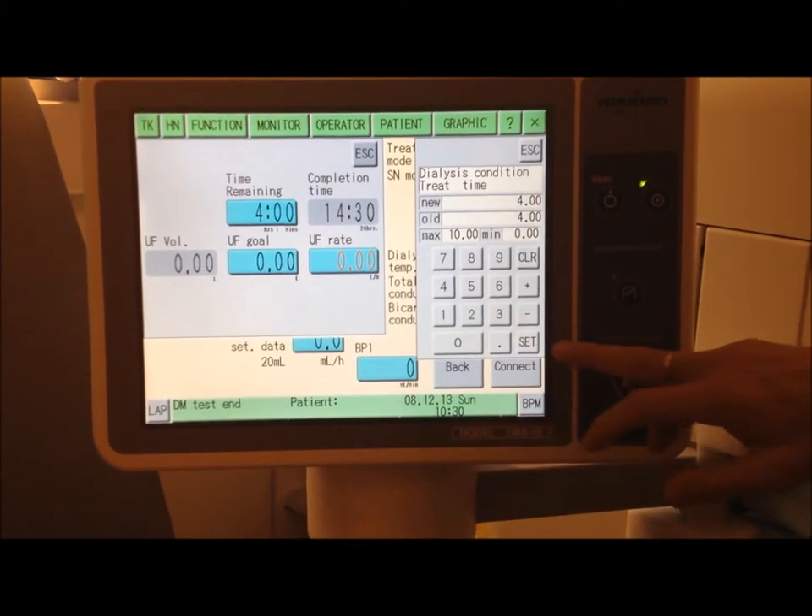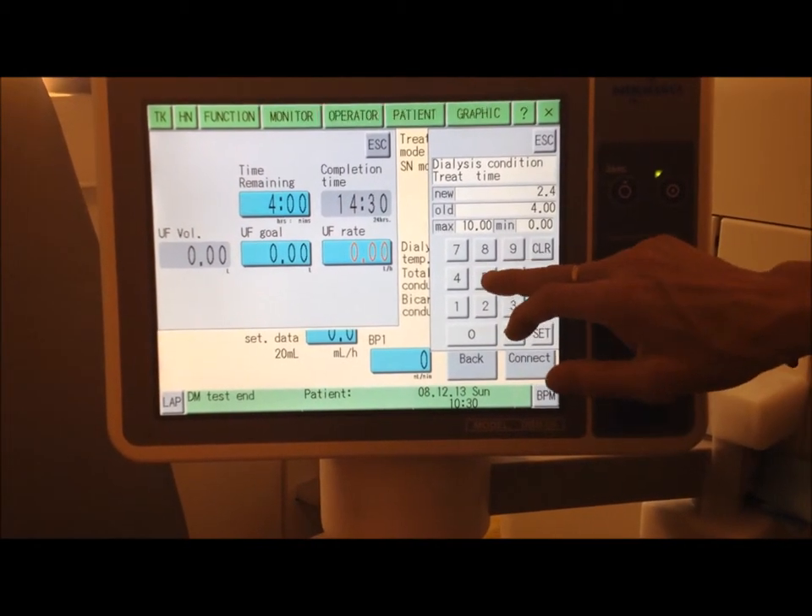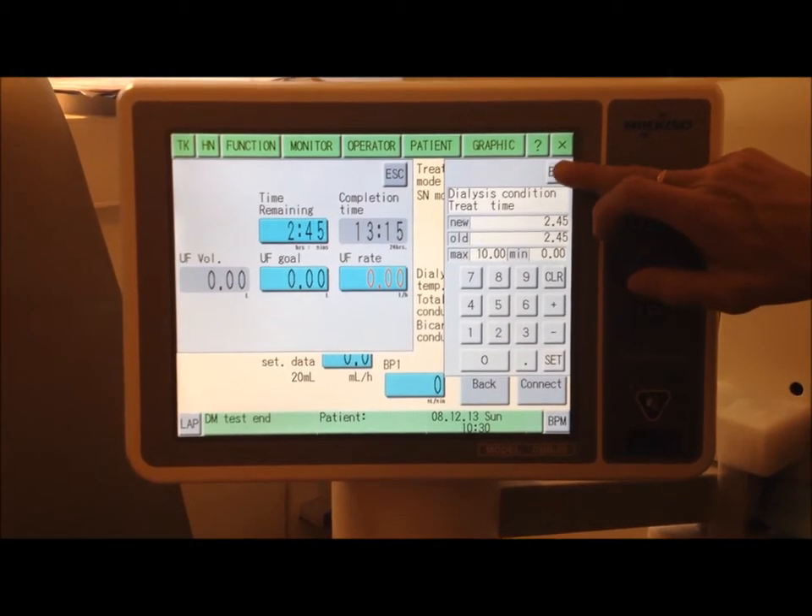Let's start again. So, input here — I'm going to go for 2.45, that's 2 hours 45 minutes. Set that. Come out of that.